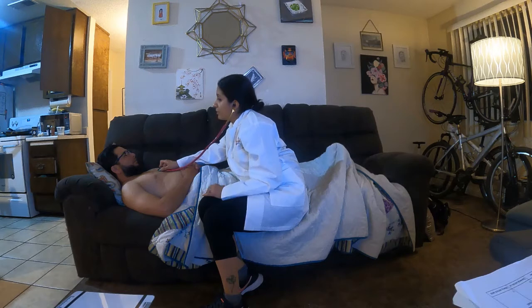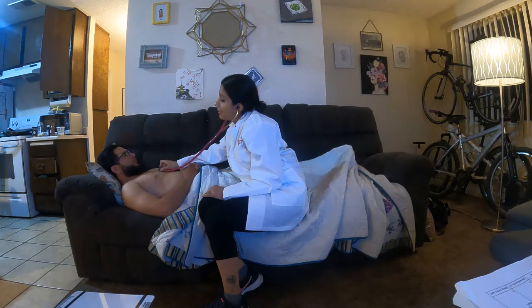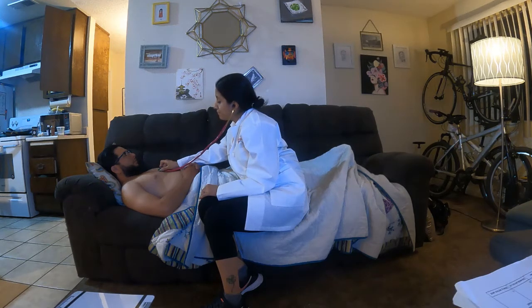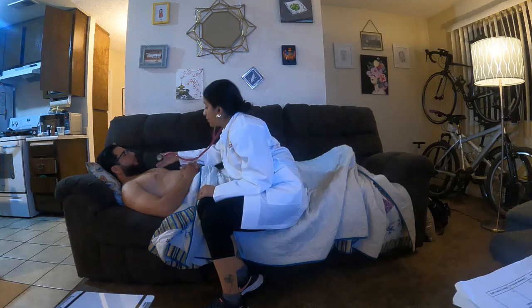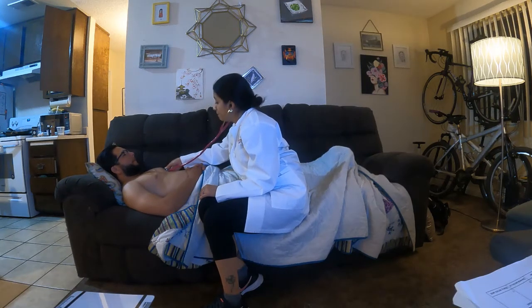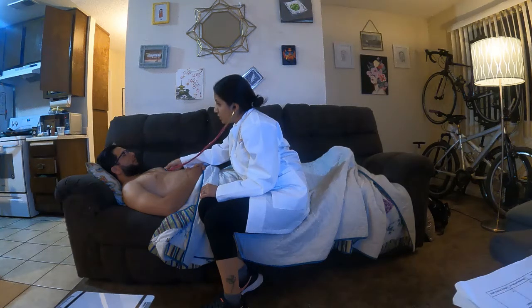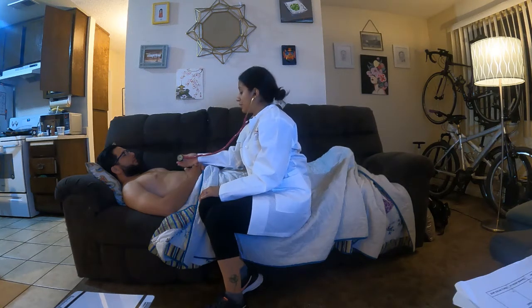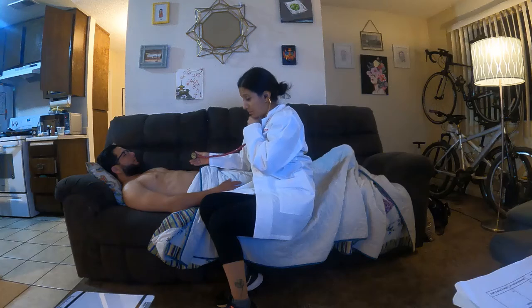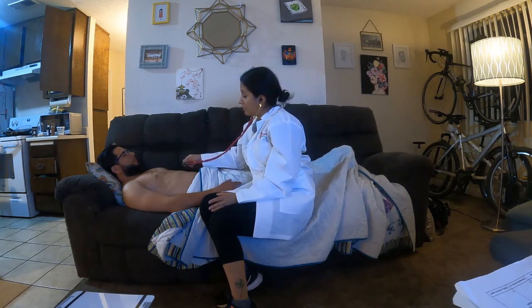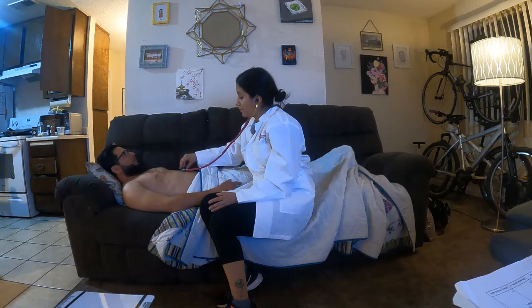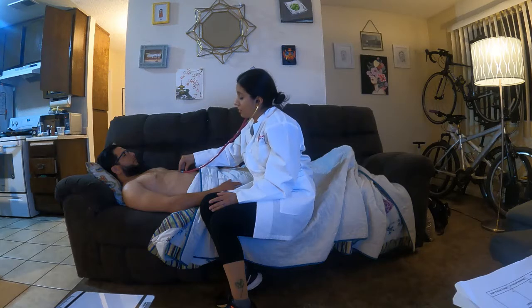I'm going to go down to the fourth intercostal space — the tricuspid area. Regular S1, S2, no murmurs noted. Then mid-clavicular line to the fifth intercostal space — the mitral area. S1, S2, no extra heart sounds, no murmurs. Now I'm going to auscultate the abdominal aorta, about two centimeters above the umbilicus. Listening with the diaphragm for bruits — none noted. I then switch to the bell for the abdominal aorta — no bruits noted.